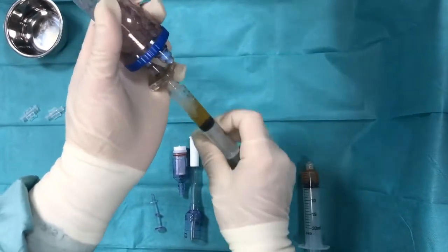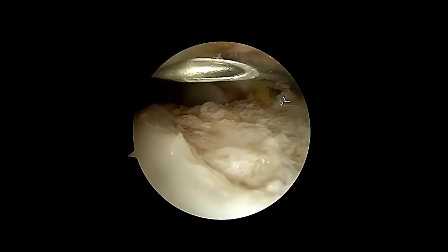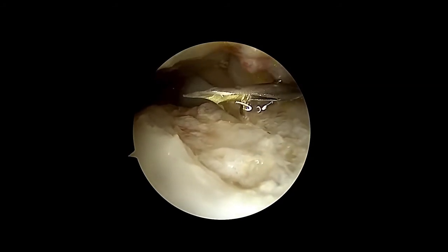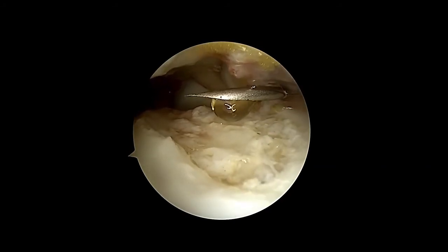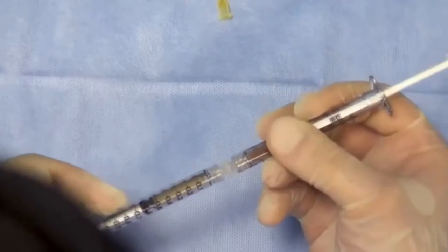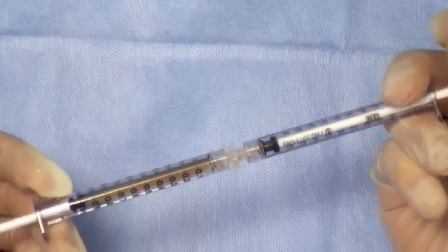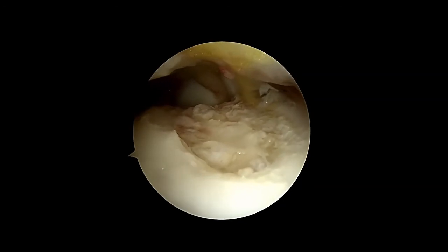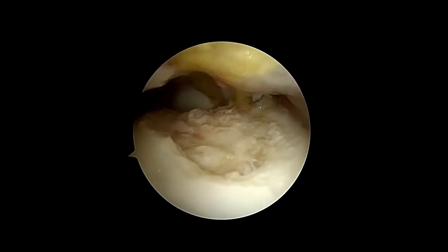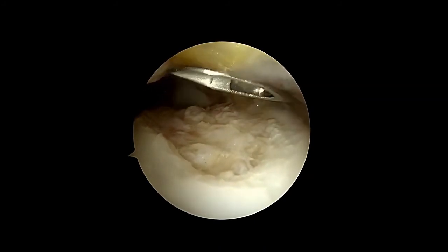Apply some drops of the thrombin solution on top of the defect to initiate gelling. By mixing ACP containing fibrinogen and autologous thrombin solution at a ratio of 1 to 1, a stable fibrin gel is created to fix the cartilage particles in the lesion, simulating the last step of the coagulation cascade.